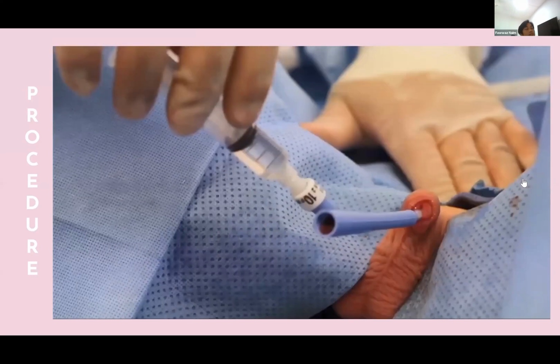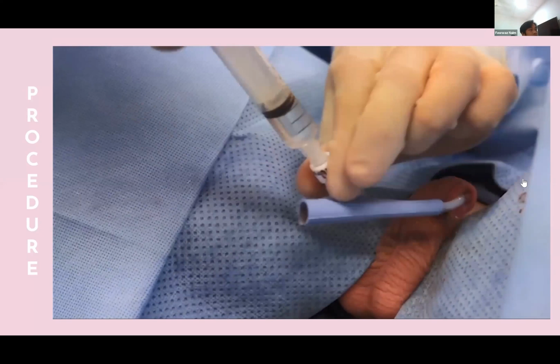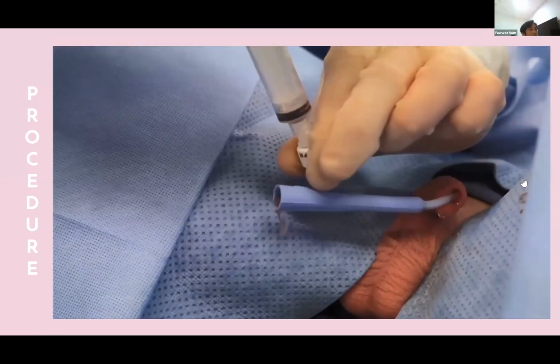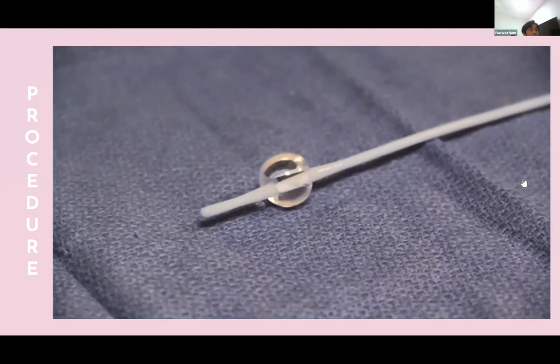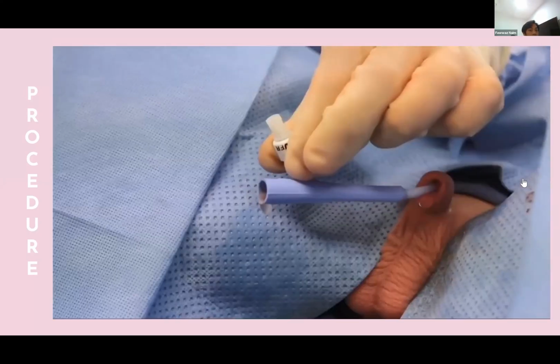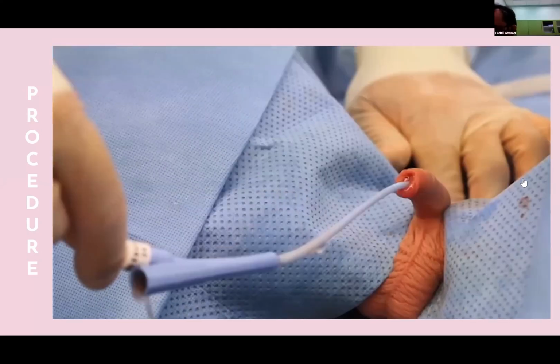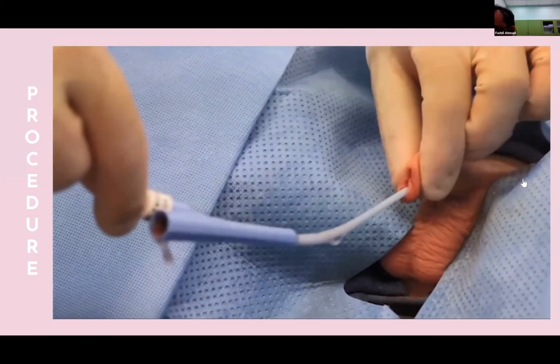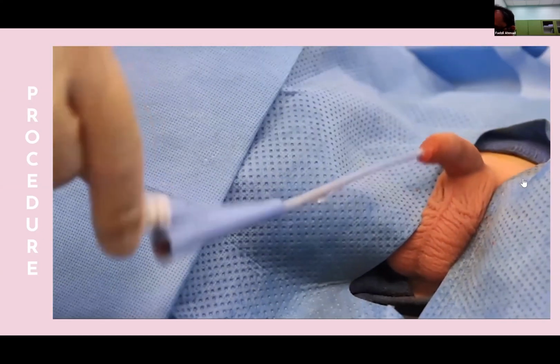Once the catheter has been confirmed to be in the bladder, the balloon should be inflated, and for most pediatric Foleys, around 3 to 5 cc of fluid is adequate. Once that has been done, the catheter can be gently pulled back in order to remove all the excess catheter from the bladder, allowing the Foley to rest securely at the bladder neck. If blood is seen in the Foley, it is important to leave the catheter in position and ask for urological assistance.